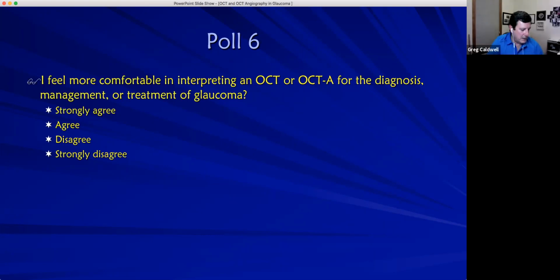Joe, I know you do a lot of glaucoma lecturing. We probably have a minute or two to fill some dead space here. Do you have any comments or anything that's sitting on your head that you can add to the OCT lecture?